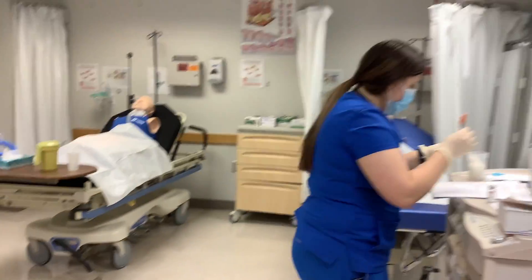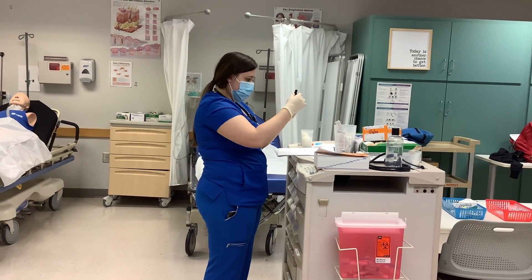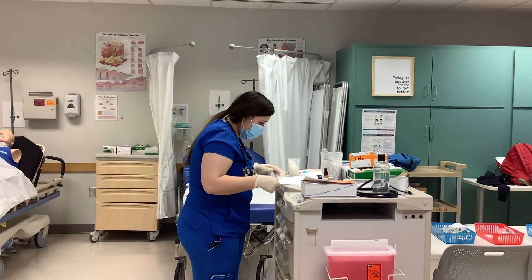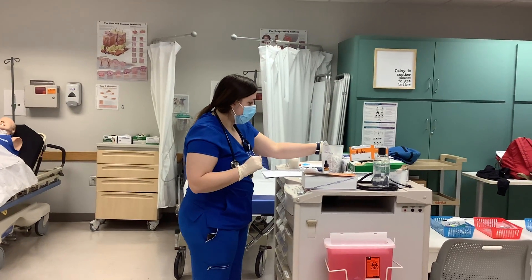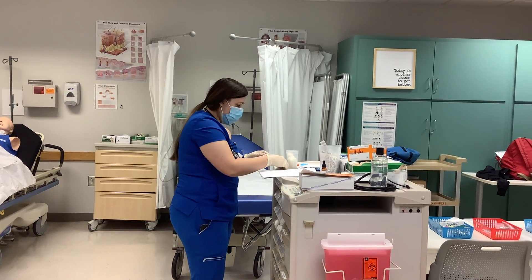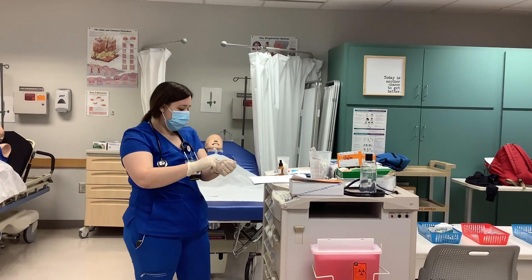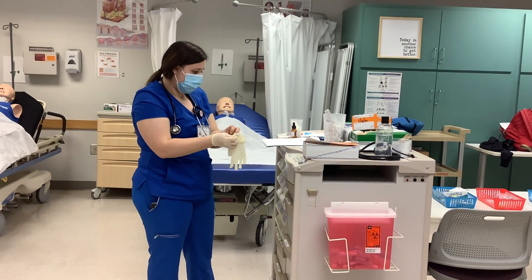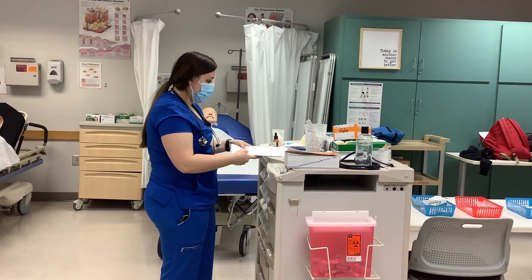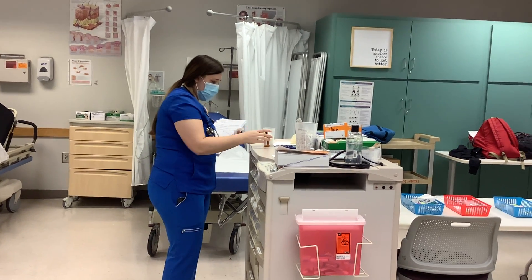We're putting our label — Humulin N, 15 units, for patient Emily Johnson. This is ready. And then we have our eardrops, which are good — we did our two checks. I'm going to bring two squares of gauze with me for each of my injections, and I have my cotton swab for any residual eardrops. Now we're going to go to the patient's room to administer the medication.